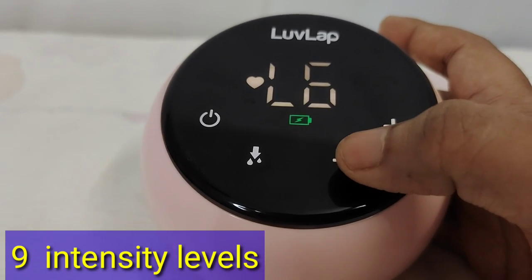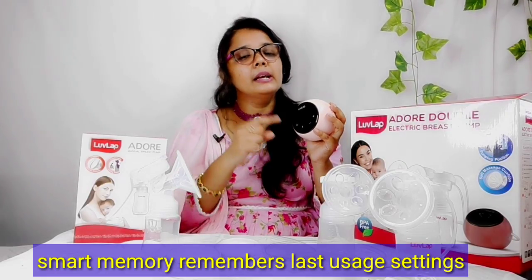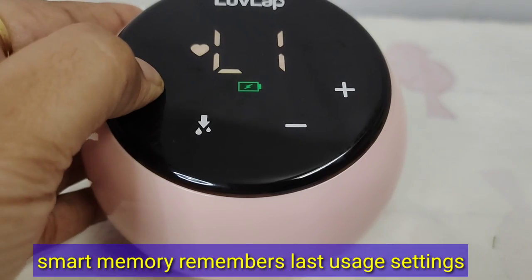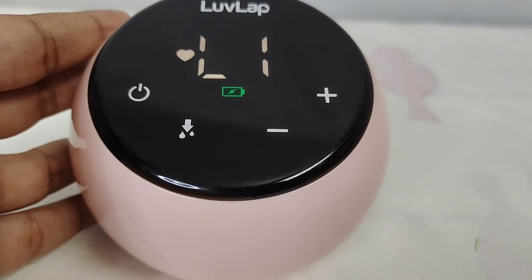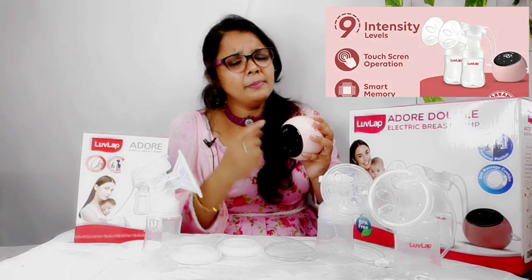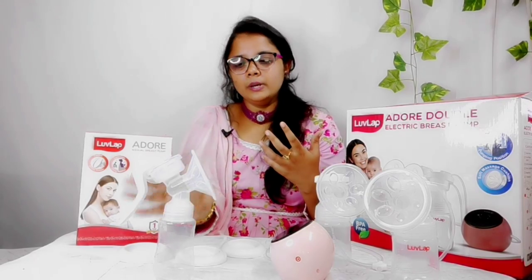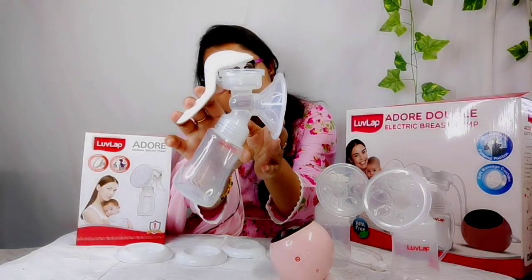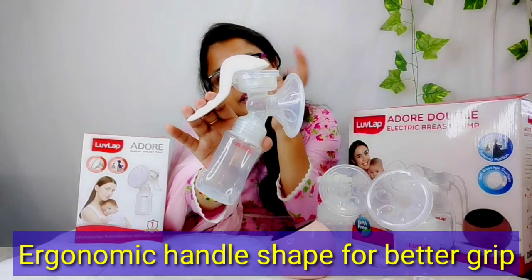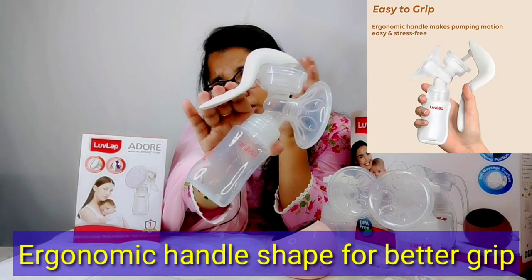The electric double-sided breast pump has a smart memory feature. The last mode and level you operated at is saved in memory, so the first time you use it again you don't have to reset your settings. The manual breast pump has an ergonomic design with a very easy and smooth grip.